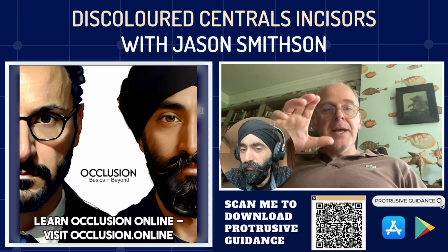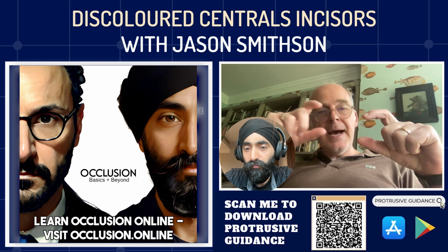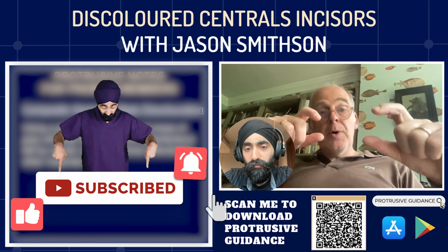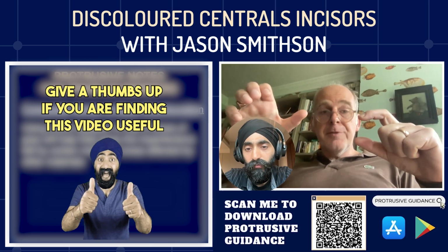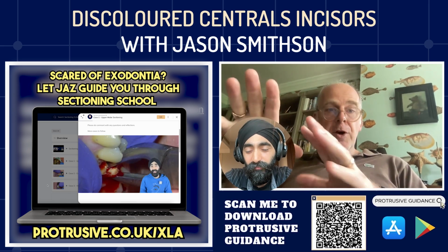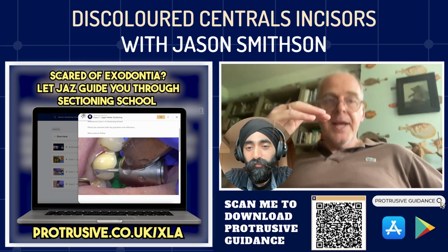So if I've got a grey discoloured tooth and I'm going down the direct resin route, what I might do is use a small amount of pink opaquer, but maybe add in some of what we call chromatic opaquer. So say the teeth were A2 and the tooth was grey, I'd use maybe 1 part of pink to maybe 3 or 4 parts of A2, A2.5, mix them together, and then I get the brightness of the pink to get rid of the grey, but I also get the chroma, the colour of the A2 to match the surrounding teeth. A lot of people just pile the pink on in one hit, and that's a bit of a mistake.